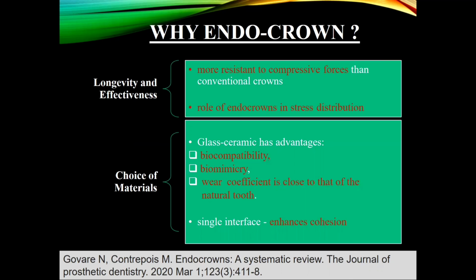So in choice of materials, we have glass ceramic, which is very advantageous to us because of its biocompatible nature and biomimetic feature, and its wear coefficient, which is as close as possible to the natural tooth. In addition, the single interface of a one-piece restoration enhances the cohesion.